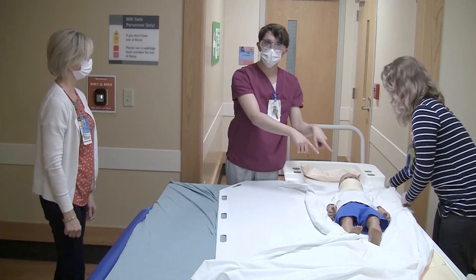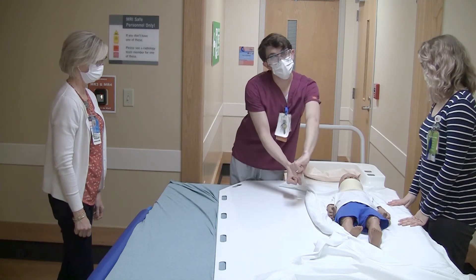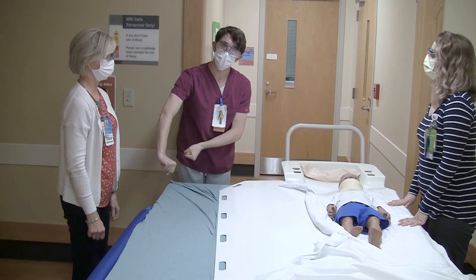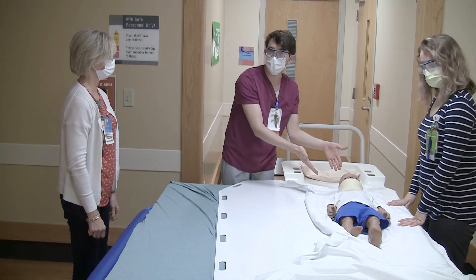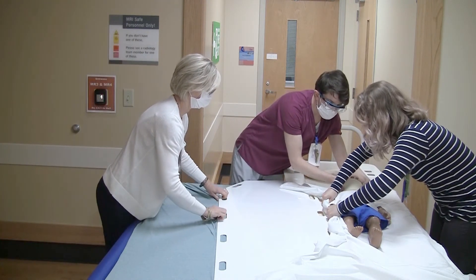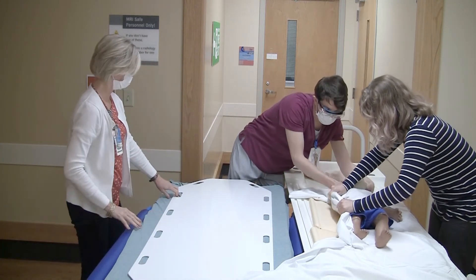Once the patient is over to the other side, Diane and Jordan are going to reverse. Jordan will grab the sheet and lift the patient while Diane pulls the slider board out. Remember, since the patient has a C-collar I will be there the entire time. Once again on the count of three. One, two, three. All right, and gently back down.